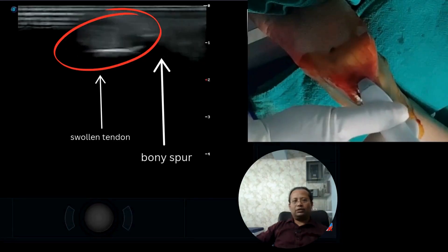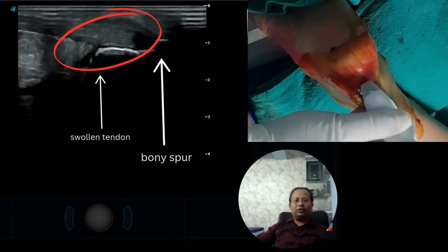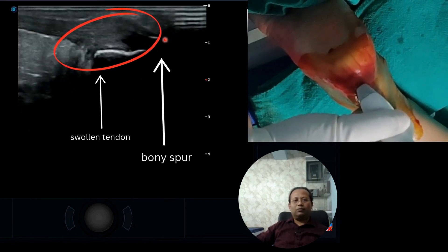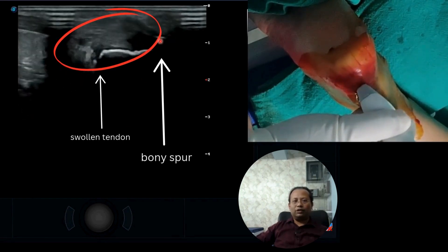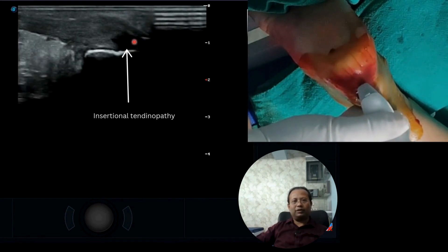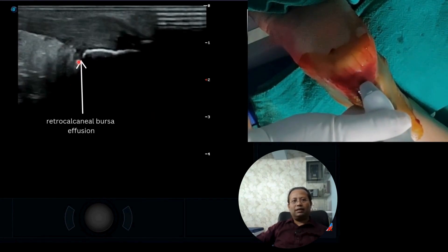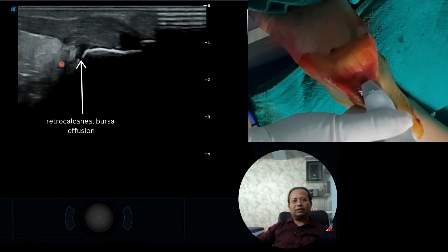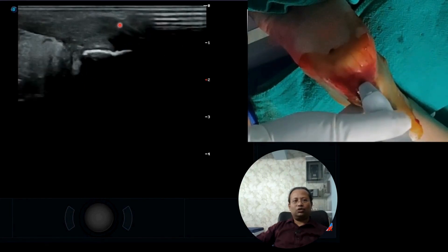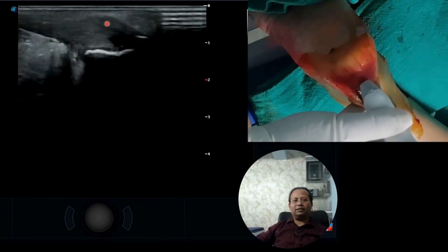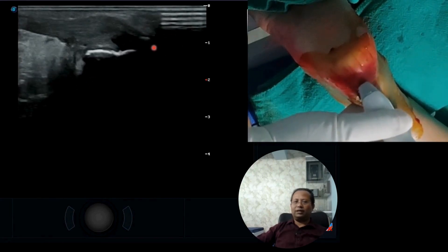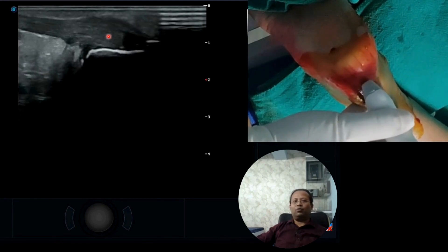Here we are diagnosing Achilles tendinopathy. We can see the bony spur — this is the calcaneal bony spur area. We can also see insertional tendinopathy in this area, along with retrocalcaneal bursa with a small amount of effusion. This is the fusiform swelling of the Achilles tendon at its insertion into the calcaneal bone.